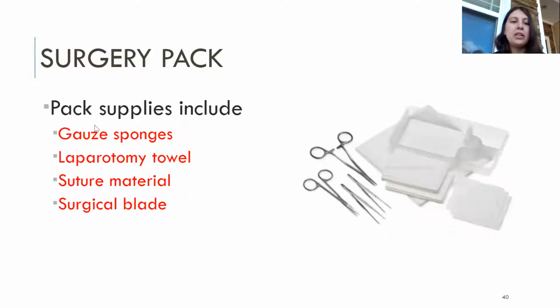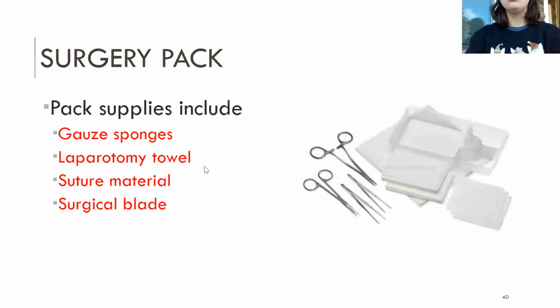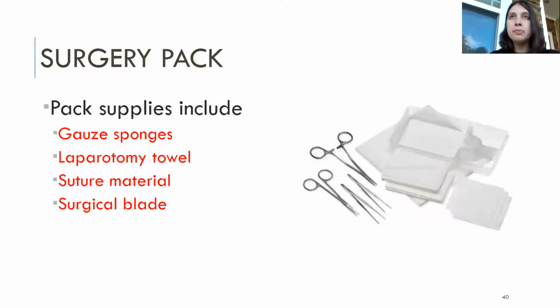So packing a surgery pack, you're definitely going to need gauze sponges, and a laparotomy towel for a surgery that's going to require the animal to be opened up. Then the suture materials, for whatever kind of material you're selecting, absorbable versus non-absorbable, the silk versus the Vicryl. The suture material needs to be in that pack. And then the surgical blade.